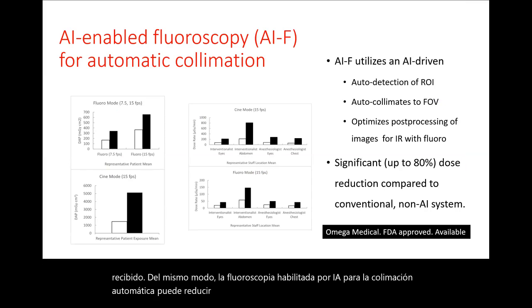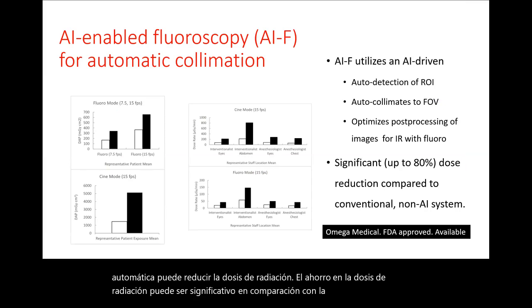Similarly, AI-enabled fluoroscopy for automatic collimation can reduce the radiation dose. The savings in radiation dose can be significant compared to the standard fluoroscopy done without AI assistance.